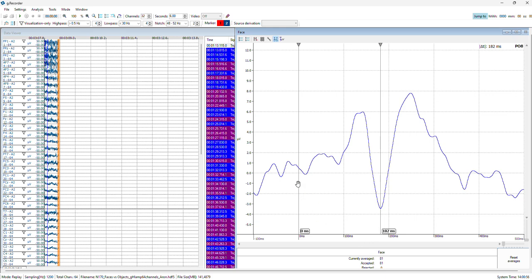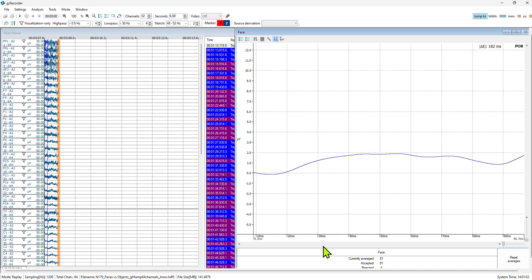And likewise, for instance, in the TMS, you would maybe be looking for the motor TEPs over here, and then you would zoom in into the first 100 milliseconds. Another thing that you can adjust is actually the amplitude view. So the amplitude view works very differently.